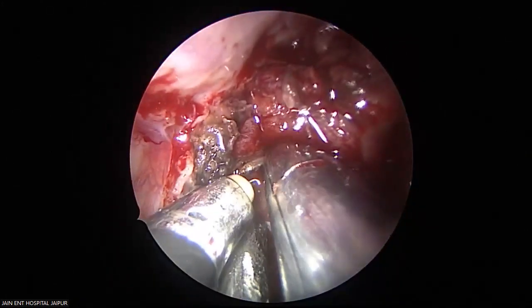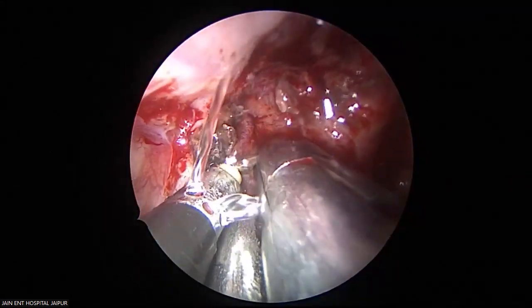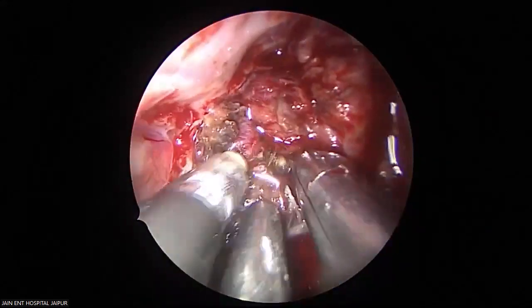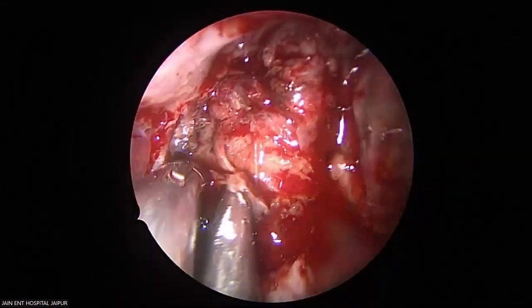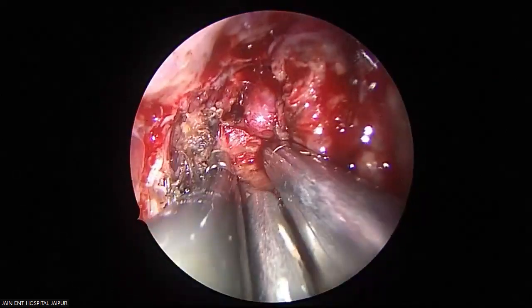Take it off. See this, I am cutting it off to go on the tumor surface. That is all tumor surface.